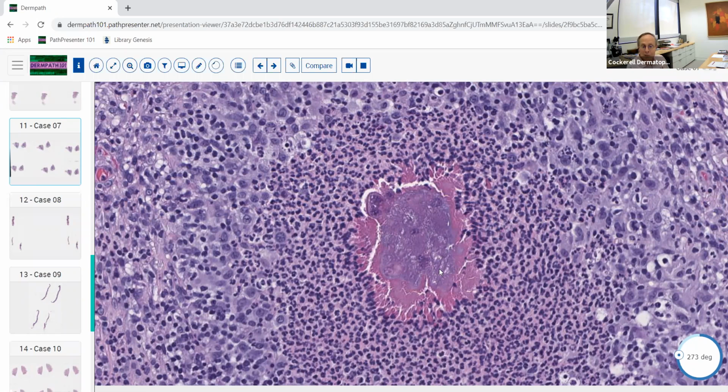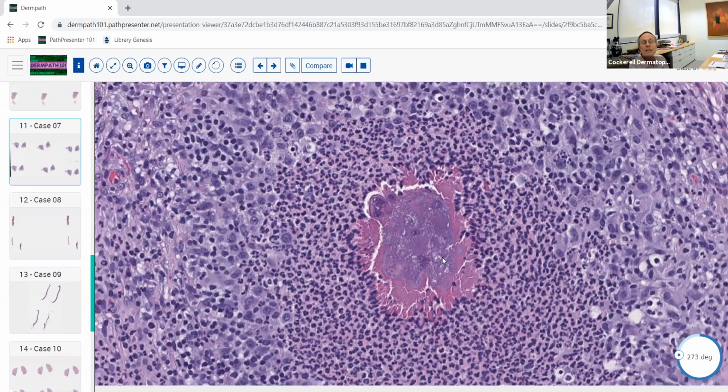And the grain is comprised of organisms, degenerated inflammatory cells, and then proteinaceous debris that gives you this material. So it's not all organisms, but there are organisms in here. And if you do the special stain, you'll see the organisms in this proteinaceous granular material here as well. So that can help you.